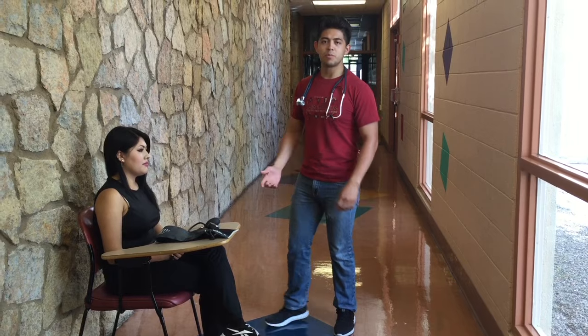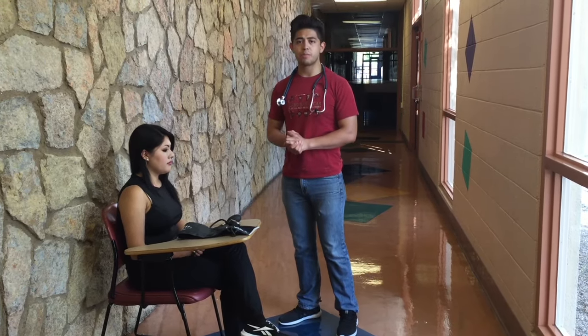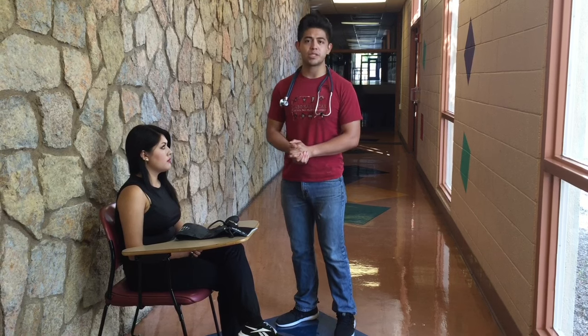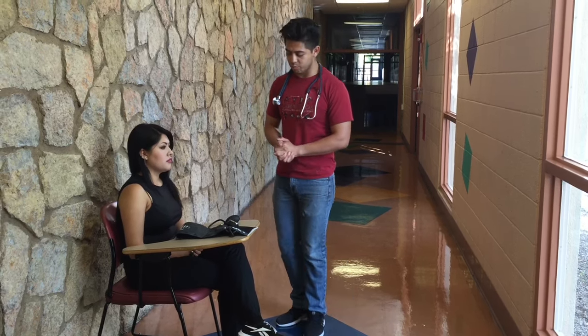Hi, today I'm going to be demonstrating how to take proper blood pressure. First, you want to make sure that your patient has not had any caffeine nor nicotine in the past 30 minutes. Assure that your patient has had at least 5 minutes of rest prior to taking the blood pressure.